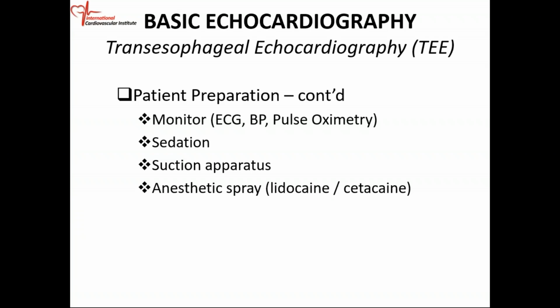Make sure you have a suction apparatus, because secretions can build up and the patient can aspirate if you're not suctioning the oral cavity. So make sure you have a functioning suction apparatus.